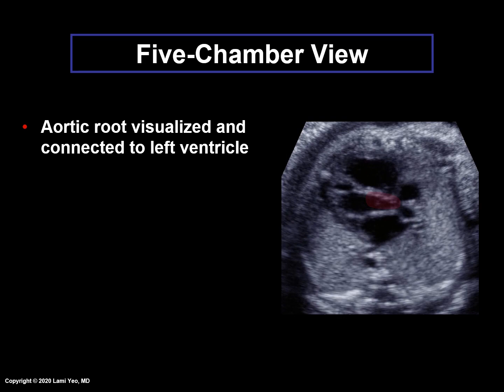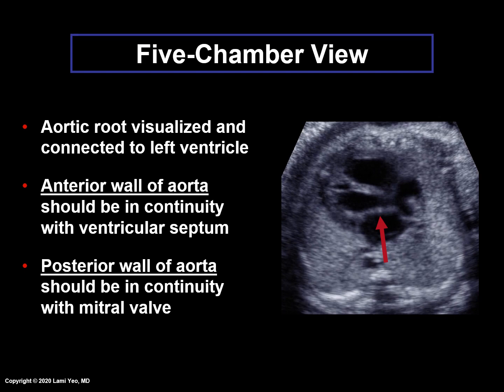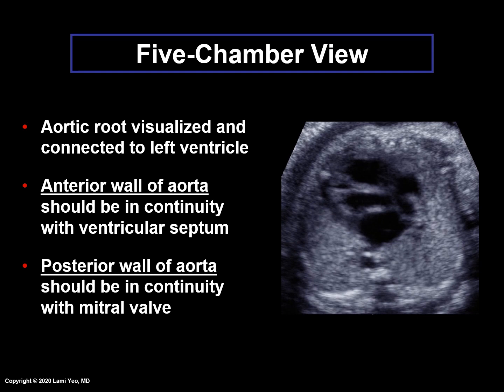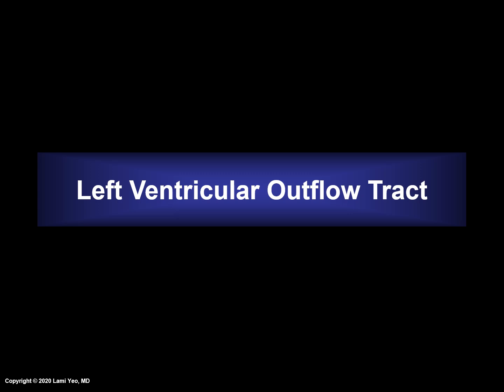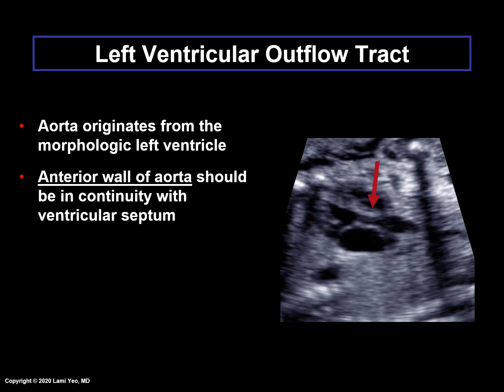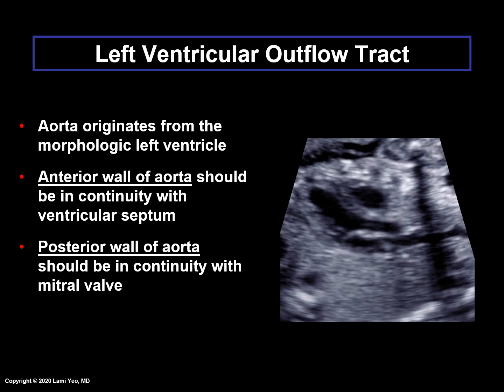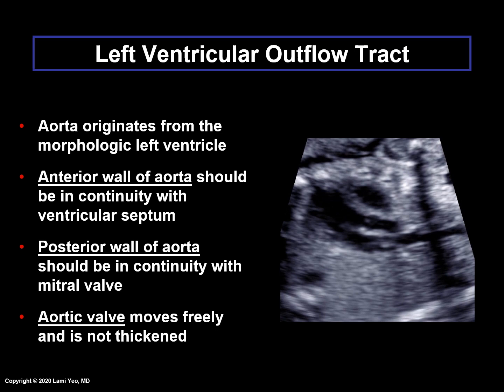Five-chamber view. In the five-chamber view, the aortic root is visualized and is connected to the left ventricle. The anterior wall of the aorta should be in continuity with the ventricular septum, while the posterior wall of the aorta should be in continuity with the mitral valve. Moreover, the aortic valve should move freely and is not thickened.